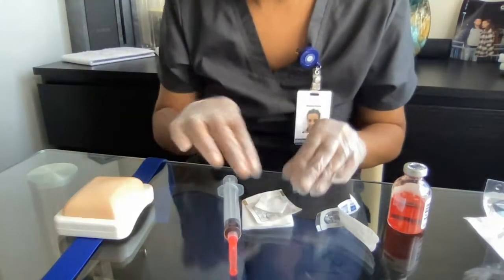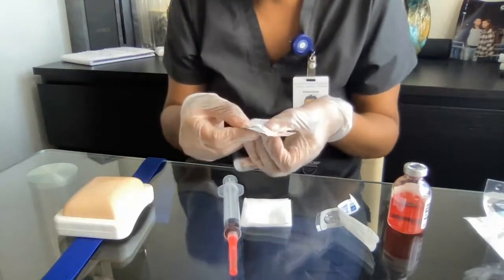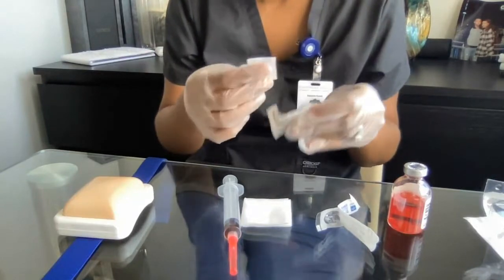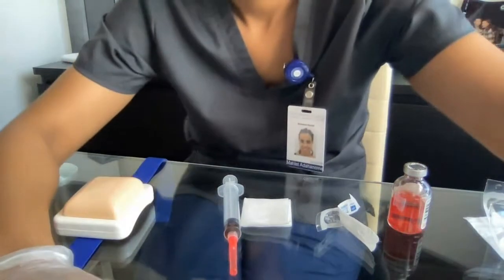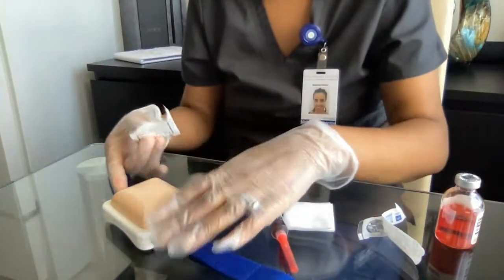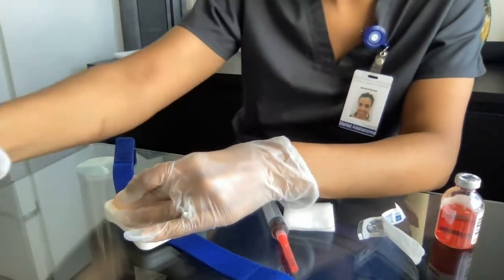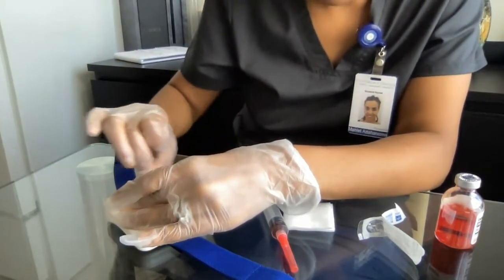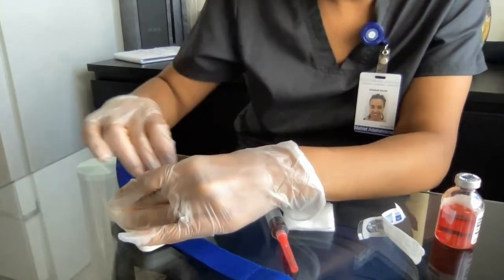And then I have my alcohol swab. I ran out, so I'm going to reuse this, but pretend that I opened a new one. I make sure I fold the skin or pinch it, get my alcohol swab, and clean in a circular motion thoroughly.